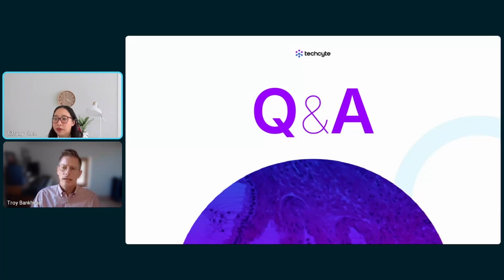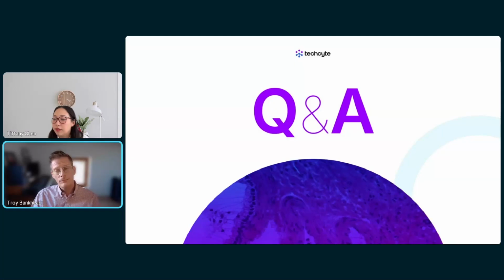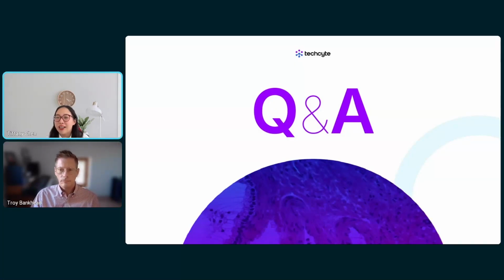Thanks. And Sean has asked, does this reduce the amount of recuts? Yeah, I mean, that's a great question. I think that's something that we'll have to see as we continue to pilot this, since this is a new product and we definitely want to compare it with a traditional process. In terms of recuts, it's still difficult to say because when you scan a slide, you're still dealing with the same issues, like tissue folding, if it's already there on the glass slide. So we'll really have to see in our pilot study what happens then.